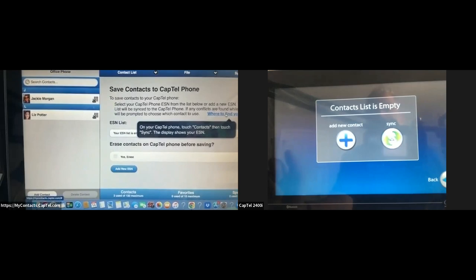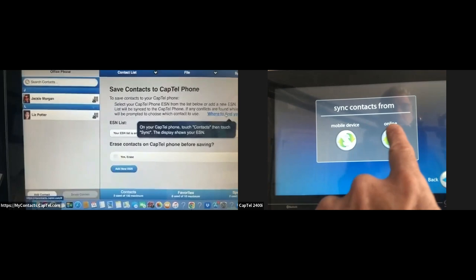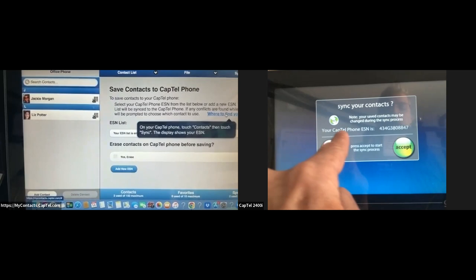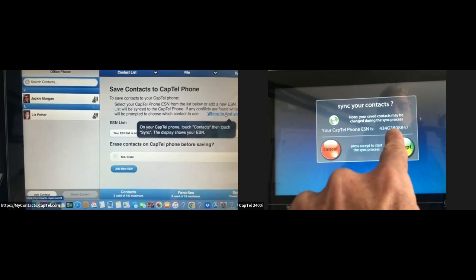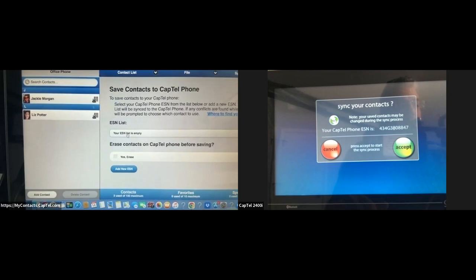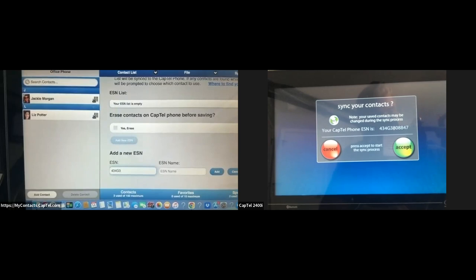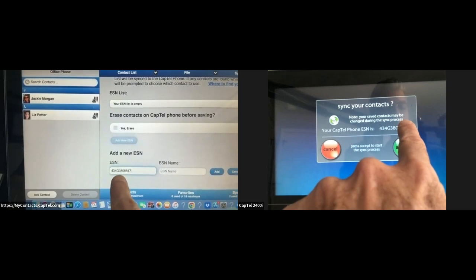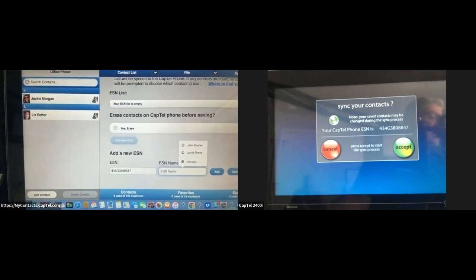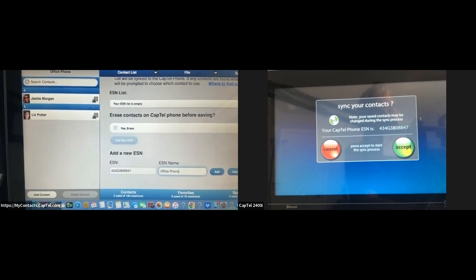I click 'Add New ESN' and enter that number: 434G3808847. Because I have two phones in my house, I'm going to label this ESN as 'office phone' and then click Add. It shows the ESN but right now it says offline, which means I need to go over to the CapTel phone display screen and click Accept. Now it says 'Ready for Sync.' So down here I'm going to click Start Sync.